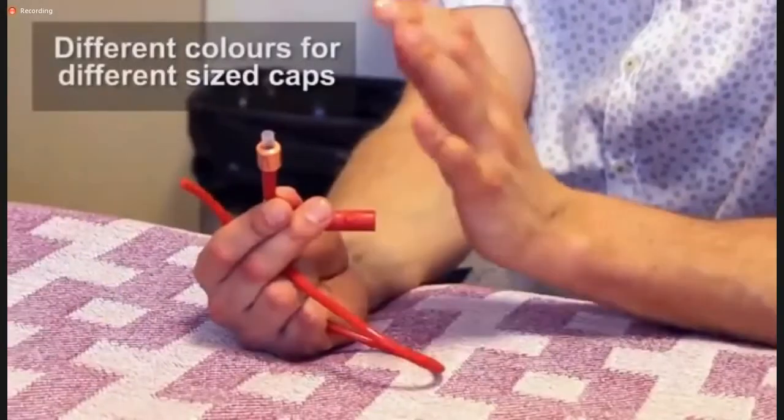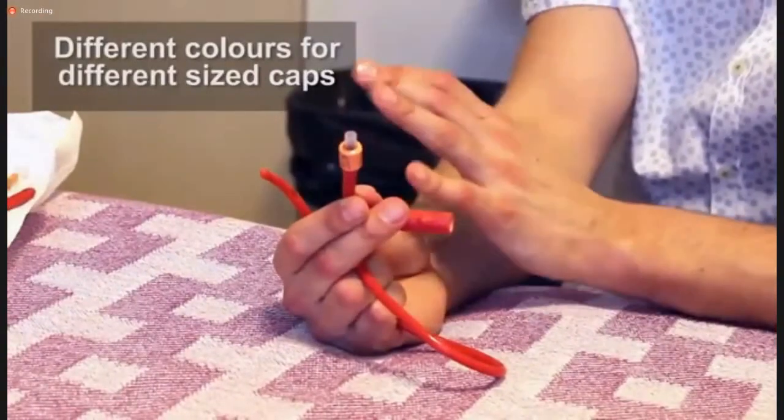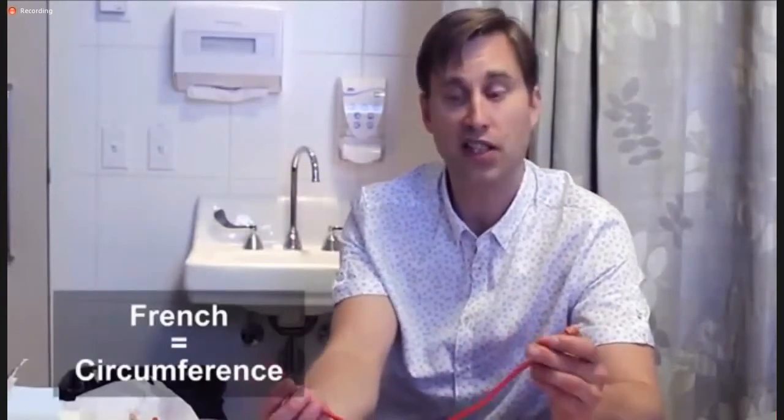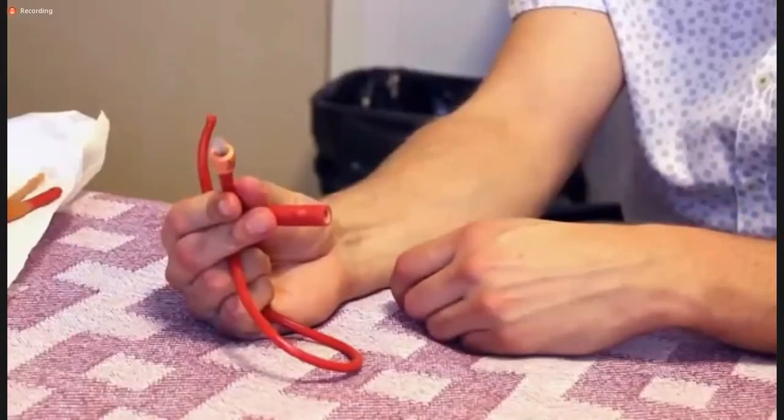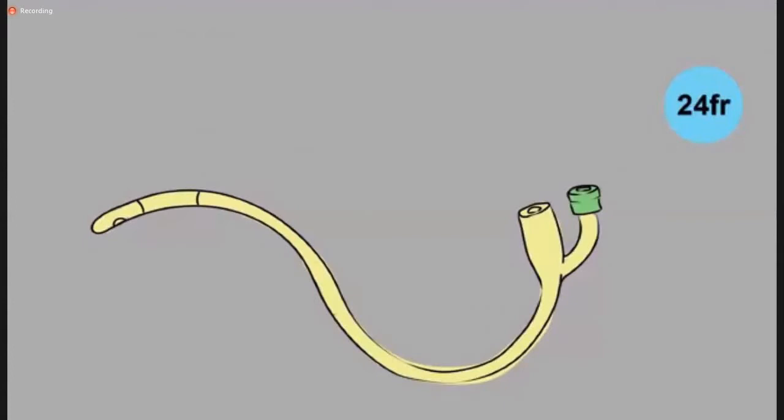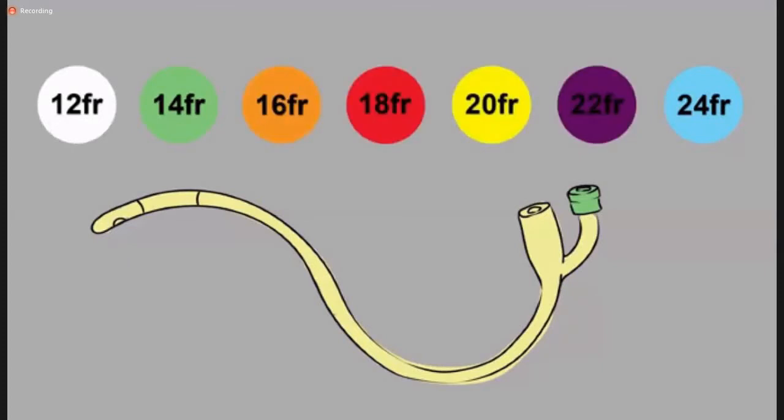The other thing you'll notice is that caps do come in different colors, which indicates the different sizes of the catheters. How we measure the size of the catheter is in a unit called French. And French is simply put the circumference. So a 16 French catheter, which is what this is, purely indicates that the catheter is 16 millimeters around in circumference. And so these caps are different colors to indicate what size the catheter is. They go all the way up to 24 French, which is a light blue cap, usually all the way down in adults to 14 French, which is a green cap, or even 12 French, which is a white cap. So quite honestly, you can look at a catheter that someone has in and know exactly what size it is by simply looking at the cap.